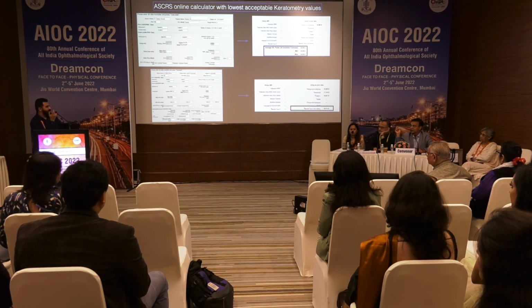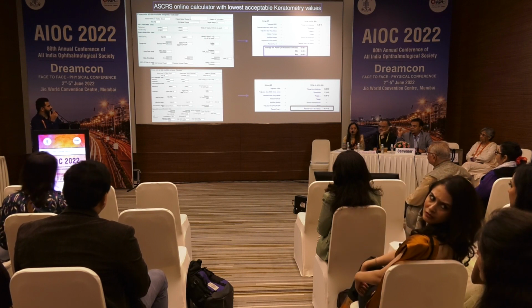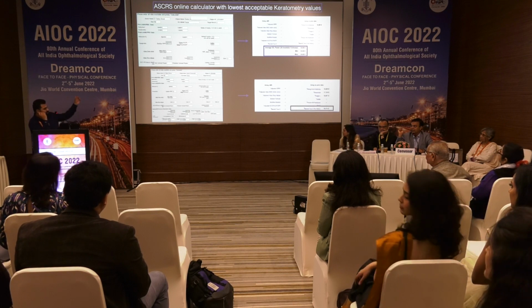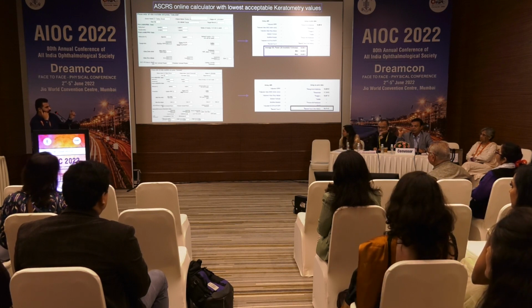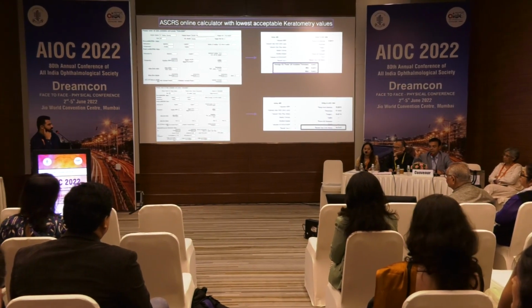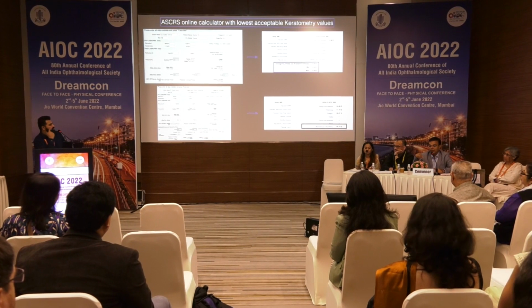The routine way that I have calculated, and which has worked very well for me, and something that we used during fellowship as well, is to use these ring values, the 4 mm zone, and that corresponds quite well with the Pentacam EKR map. But yes, I think what you are doing is probably the way to go in this case, because I haven't done that.